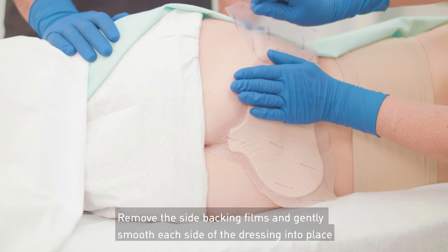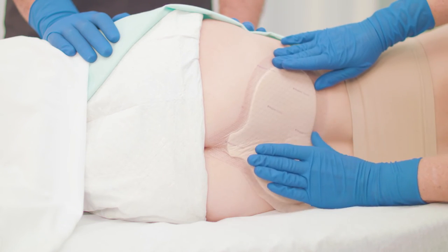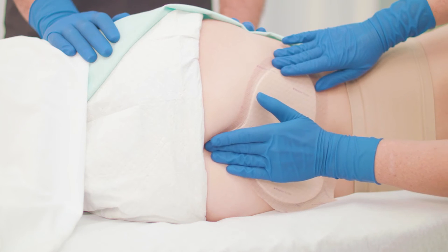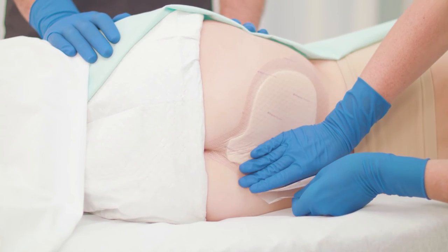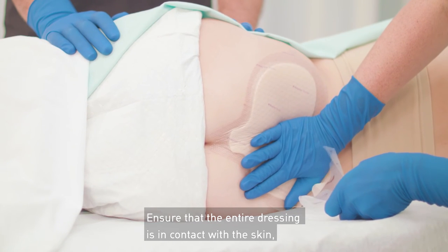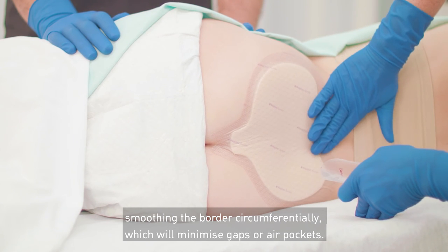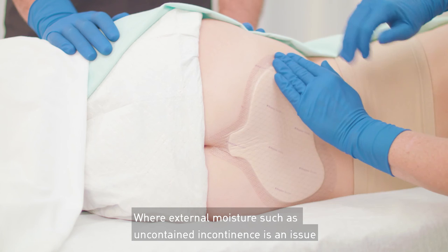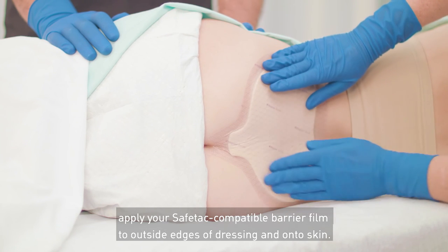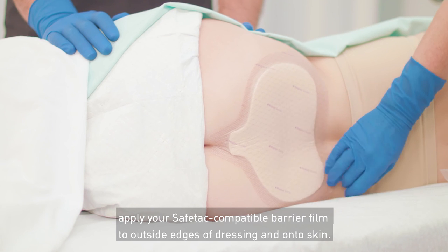Remove the side backing films and gently smooth each side of the dressing into place. Ensure that the entire dressing is in contact with the skin, smoothing the border circumferentially, which will minimize gaps or air pockets. Where external moisture such as uncontained incontinence is an issue, apply a SafeTac compatible barrier film to the outside edges of the dressing and onto the skin.